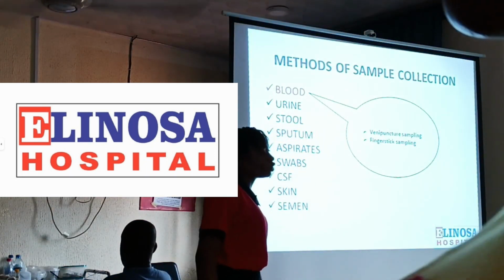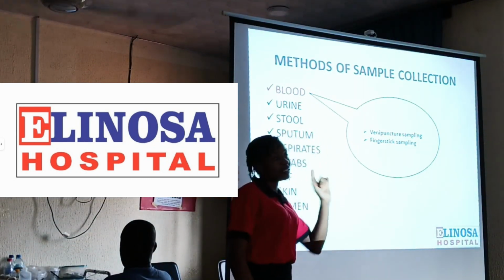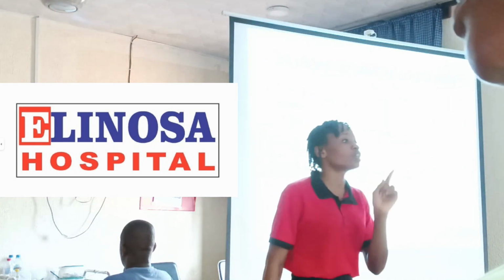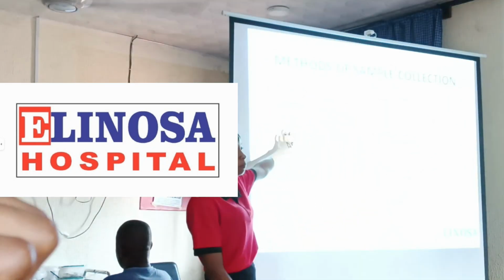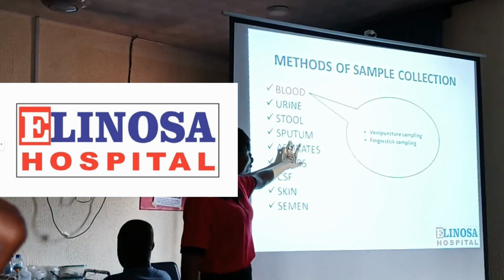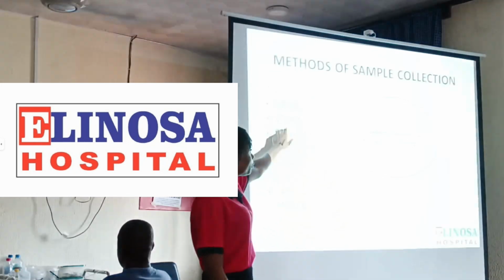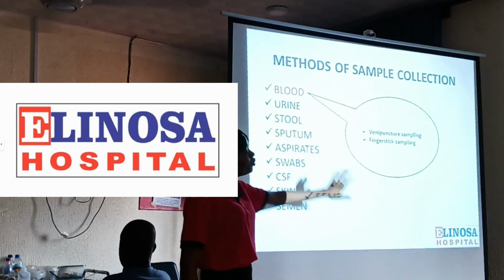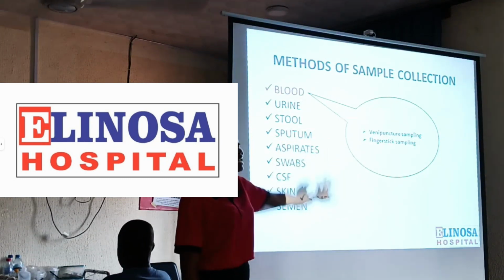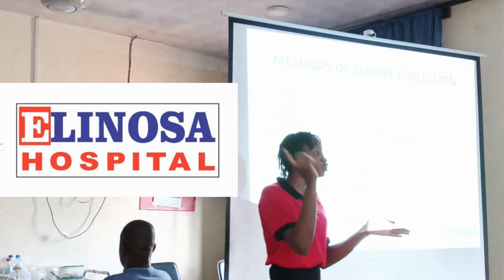Now we also have sputum. We use sputum in the laboratory to also test for the presence of parasites, because there are some parasites or bacteria that can be found in the sputum. And the patient should also be told not to bring saliva, because the results produced are only as good as the sample itself. Sputum is normally collected early in the morning when the patient has not eaten, brushed or even drunk water.